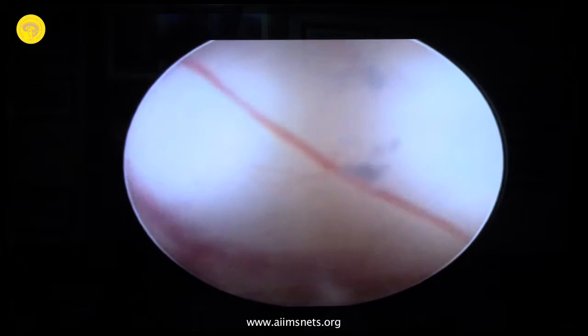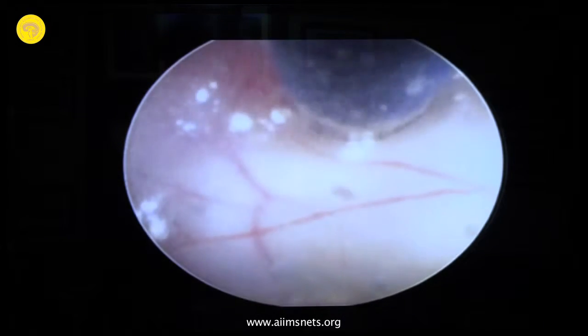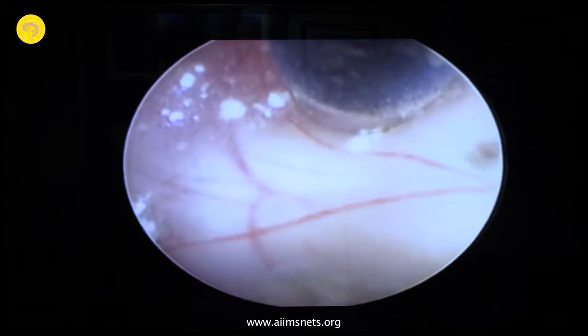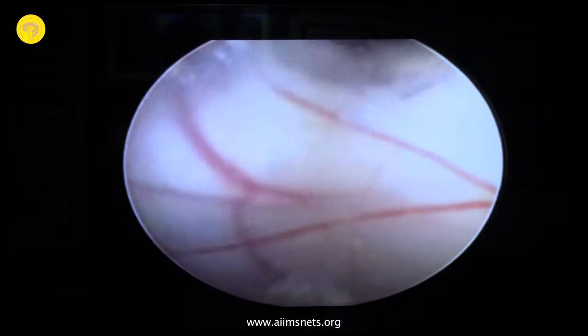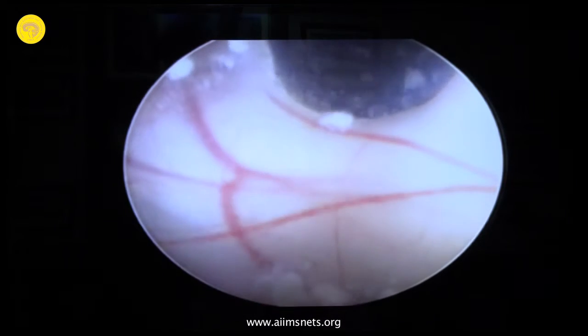Now there are no landmarks. You don't know where you are. You don't know where the basilar artery is, and sometimes there may be a part which is calcified. This is a moment of truth. Make small, small monopolar openings, and just make sure that you see. Can you go there? Yes, you can see the cistern there. Oh, that's great. You can see the cistern there, right?